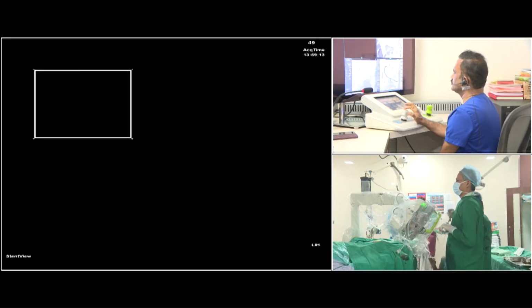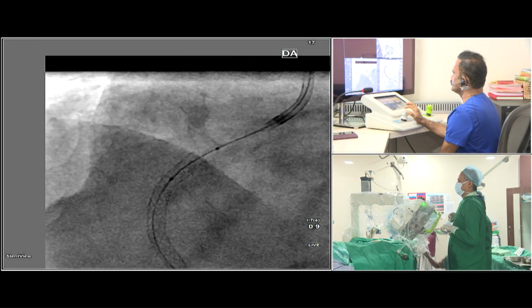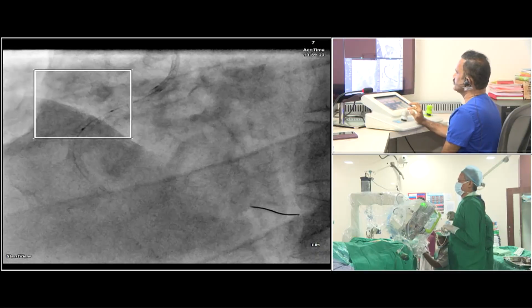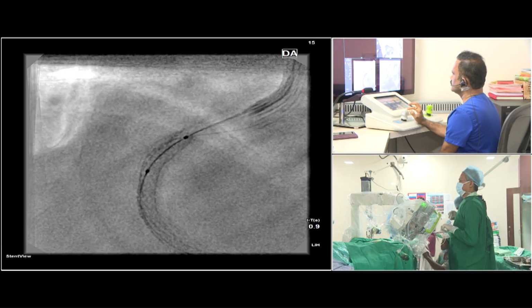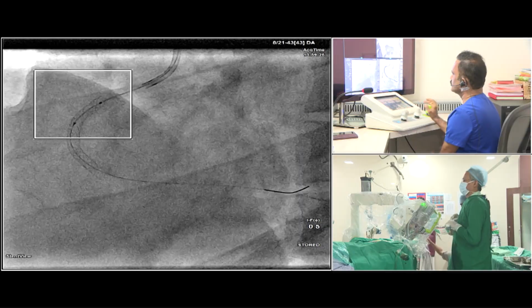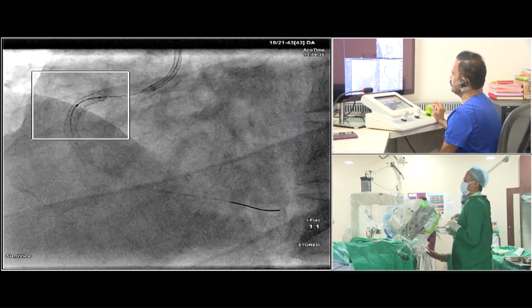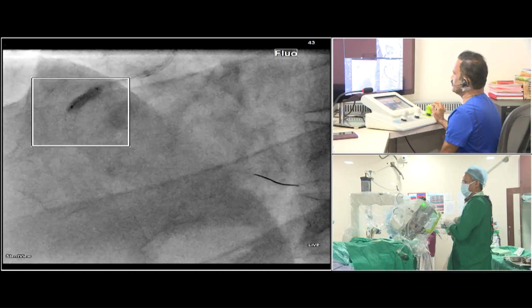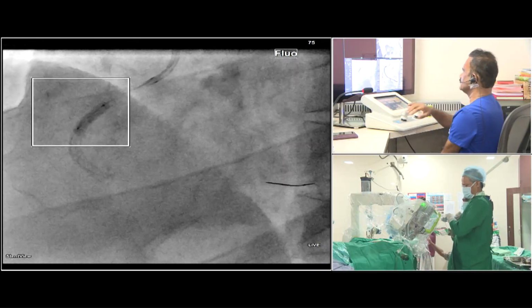Check. Yeah, check. Go 18. Going up to 12, 14, 16, 18.